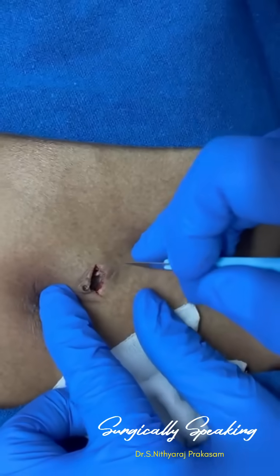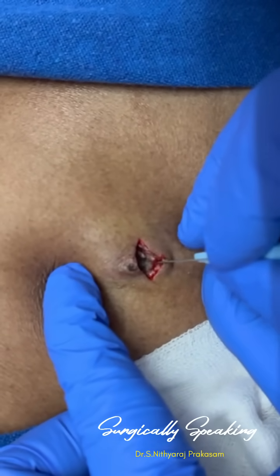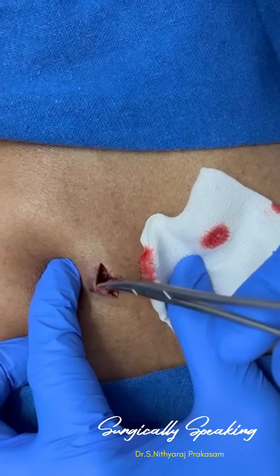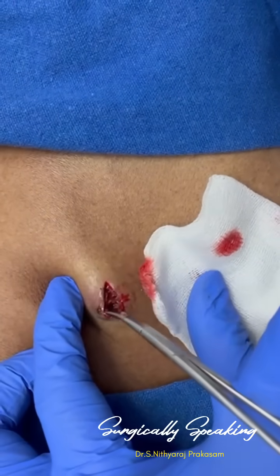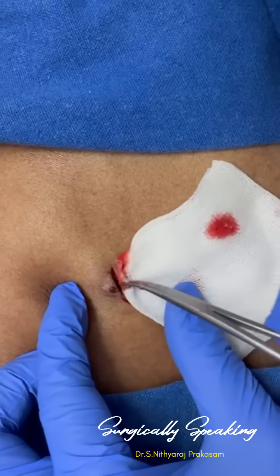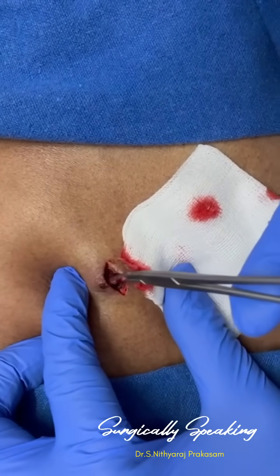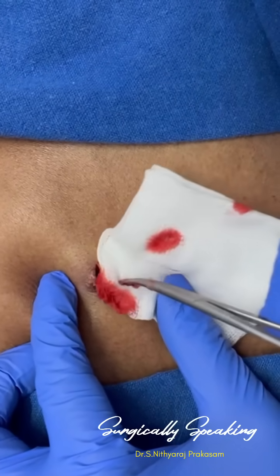I don't know if you will be able to see inside. You can see this black thing. That is the capsule. That is the infected capsule. We will not be able to remove that, so trying to remove that is not going to be useful. So we just leave that there, do some dressing, and ask the patient to come back for a definitive excision after this wound has healed. So I'm not going to meddle much now.